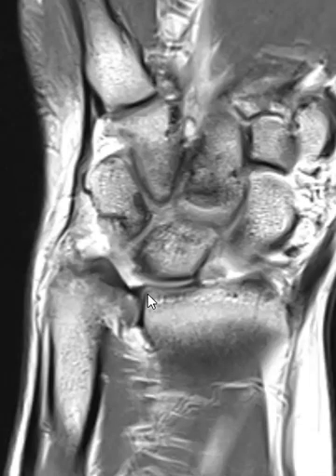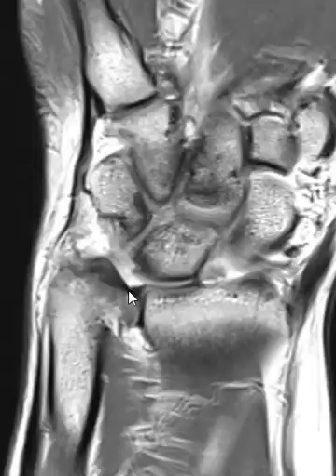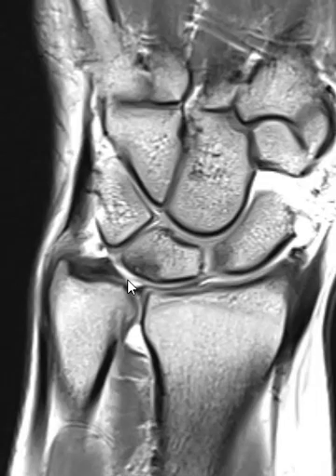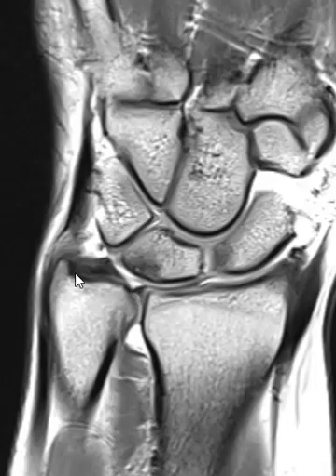If we go towards the palmar aspect, it looks pretty thin there. You can kind of see this gray band, so it looks like a full-thickness or near full-thickness tear of the central disc. It also goes a little bit into the palmar band. The foveal attachment is okay, the styloid attachment is okay.